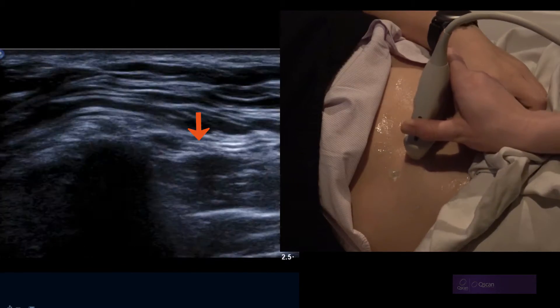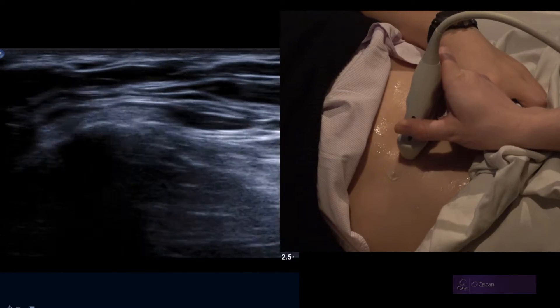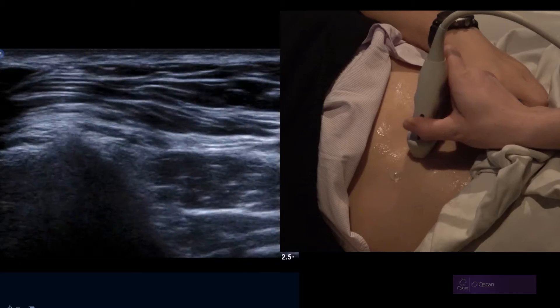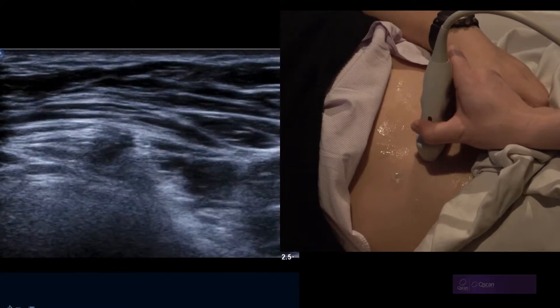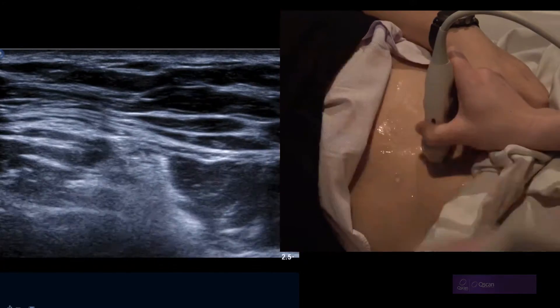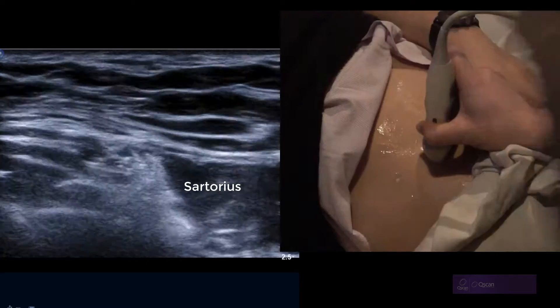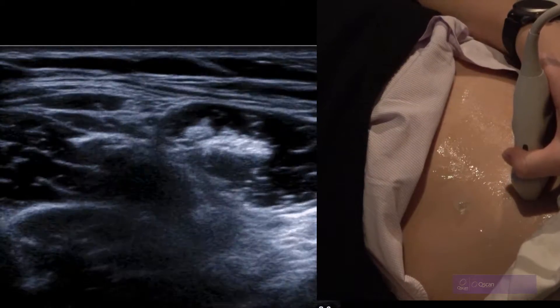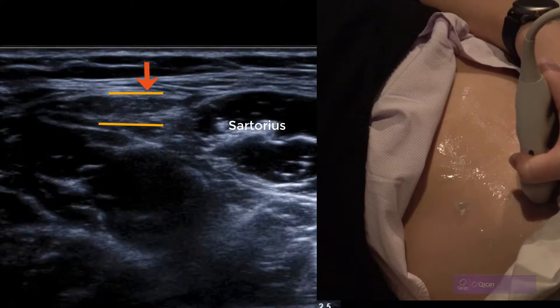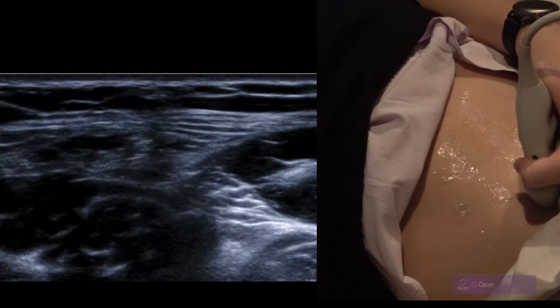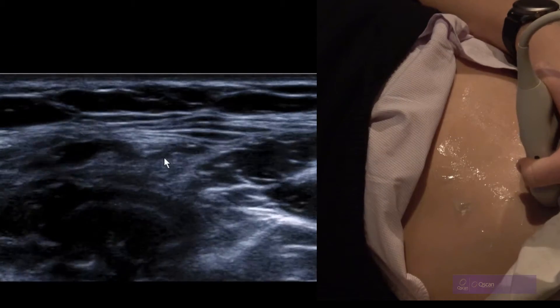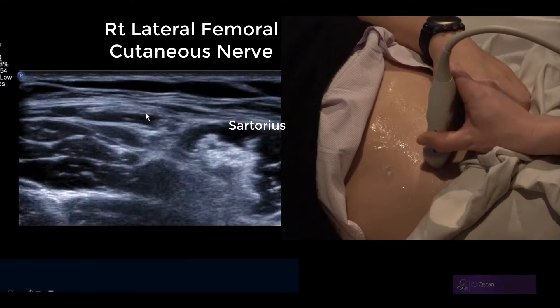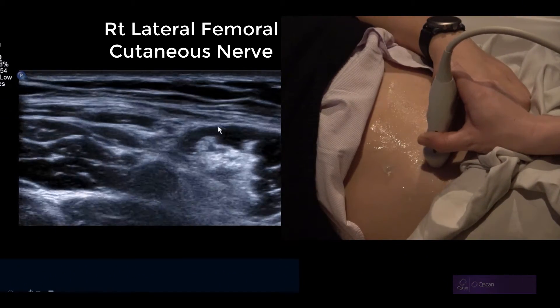We always start at the ASIS in transverse and then just rock on to that medial end of the probe footprint. It emerges from usually beneath the inguinal ligament and then courses south within two layers of fascia, just lateral to sartorius or over the surface of the sartorius. You can see it's now lateral to sartorius and then it goes down the anterolateral thigh.